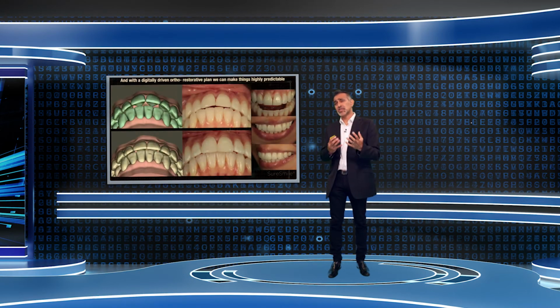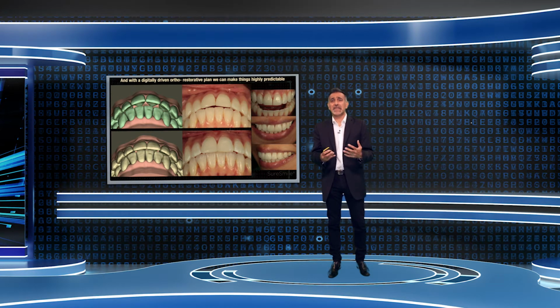And with a digitally driven ortho-restorative plan, we can make things highly predictable. Now this patient, as you can see, she's got a little bit of upper misalignment. This is actually towards the end of a failed Invisalign case. It just didn't complete out. And this patient presented to me, and we basically used some SureSmile aligners to align her teeth and get them to the position we wanted to, because we really were after a correct overjet, overbite for proper anterior function.